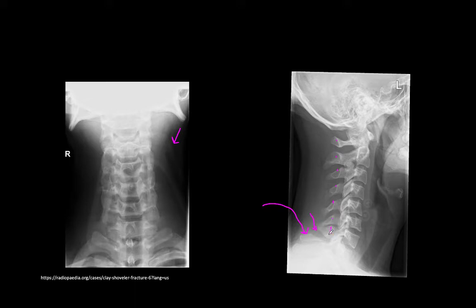You'll see the spinal laminar junction is quite proximal to that fracture site. The biggest thing with Clay-Shoveler's fractures is they always go non-union, so you don't expect them to reattach through healing. This seems to be an acute fracture, but even in old fractures, the fragment will not be attached. There is a name sign associated with this Clay-Shoveler's fracture, also known as root puller's fracture or coal miner's fracture.